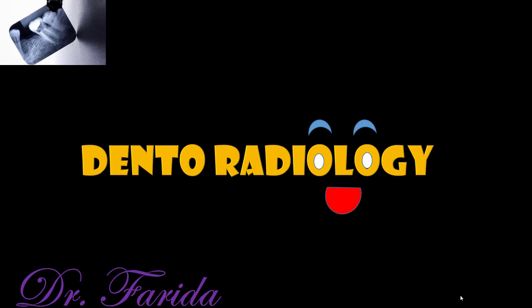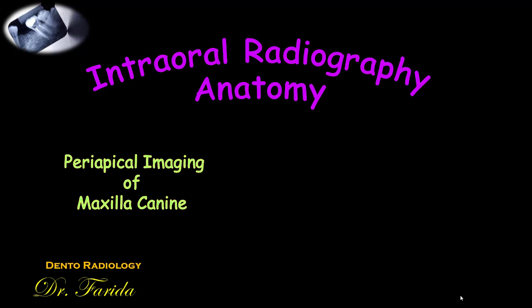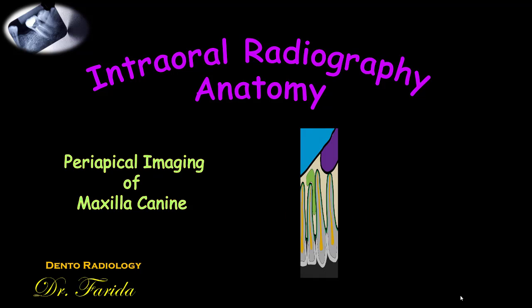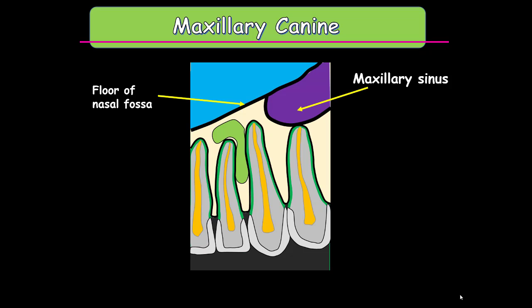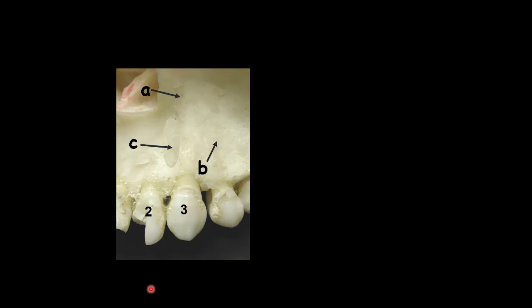Hi everyone, this is Freda and welcome to Dento Radiology. Let's continue the intraoral radiography anatomy — periapical imaging of the maxillary canine, and what we see in the periapical radiograph of the maxillary canine: the floor of the nasal fossa, the maxillary sinus and its floor, and the lateral fossa. Now let's see the facial view of the maxillary bone.